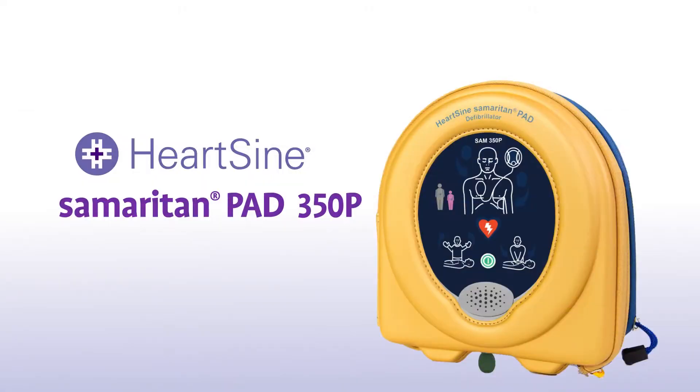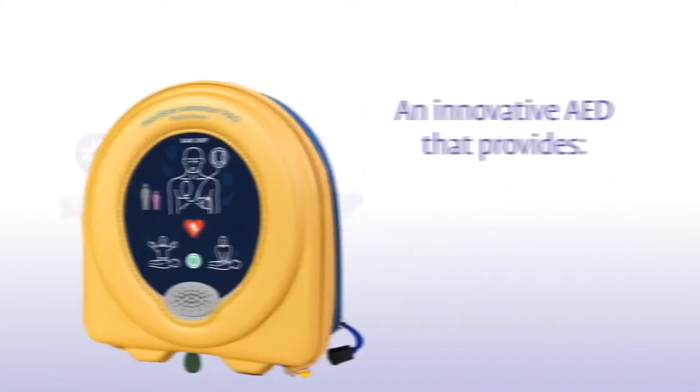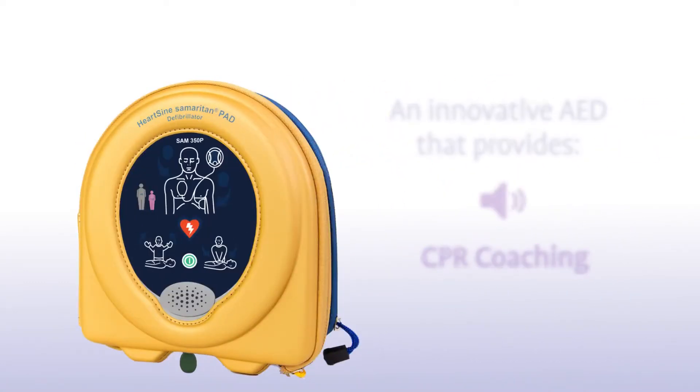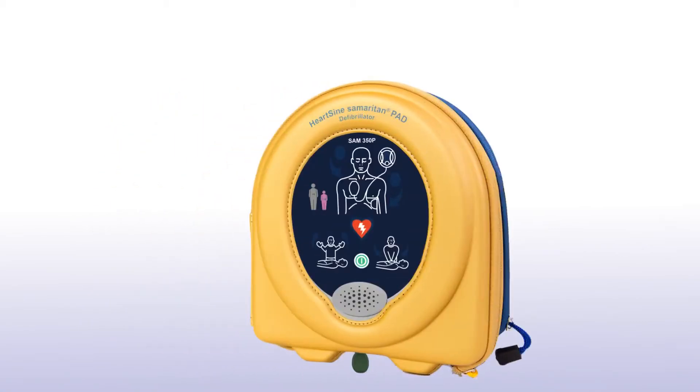The HeartSign Samaritan PAD 350P is an innovative AED that provides audio-visual CPR coaching. Let's look at how to use one in a life-saving situation.